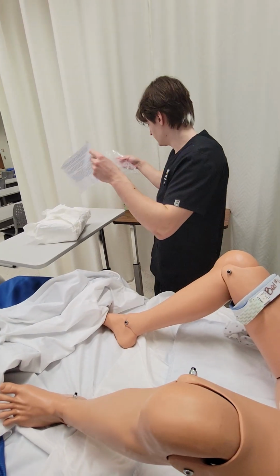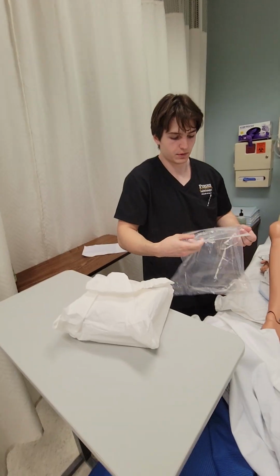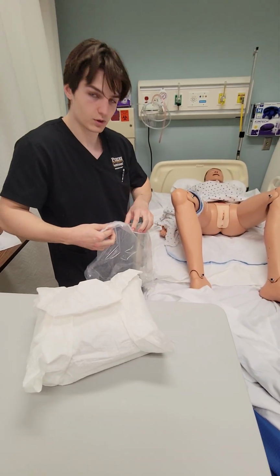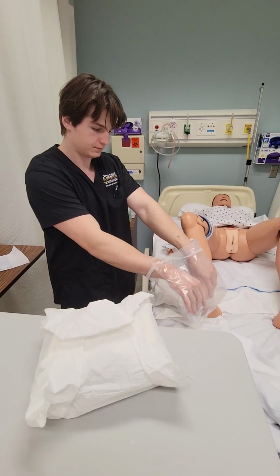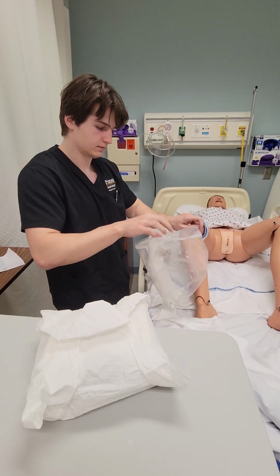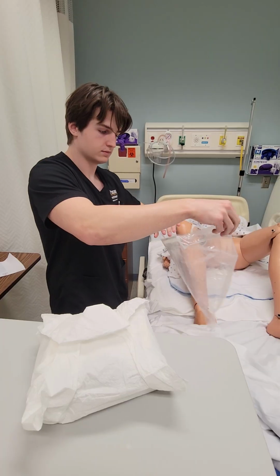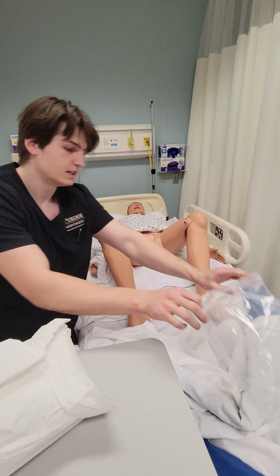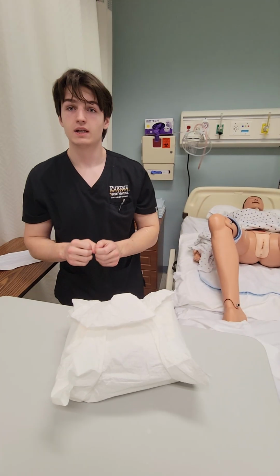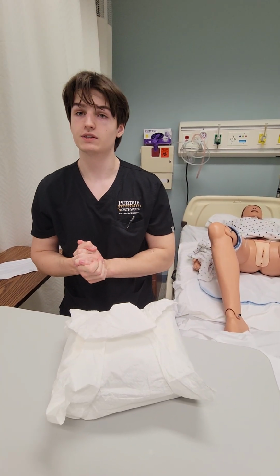Supplies here. Move the paper out the way. Turn this plastic part into a garbage bag for all the used materials from this procedure. Plastic being difficult. Okay, there we go. So now on to the Foley catheter. I'm going to try my best to use sterile technique here.